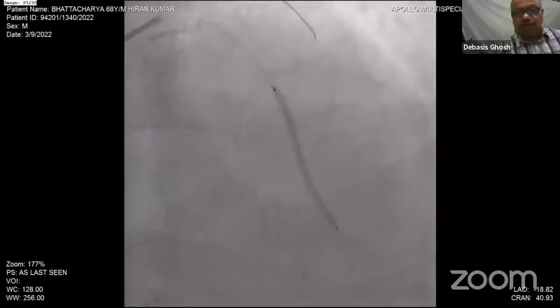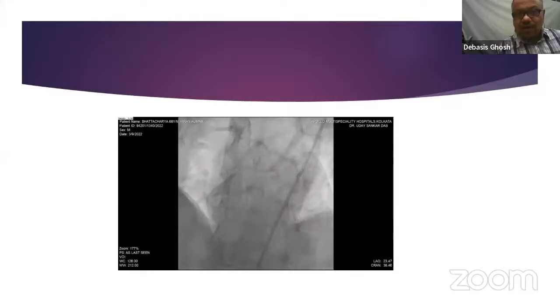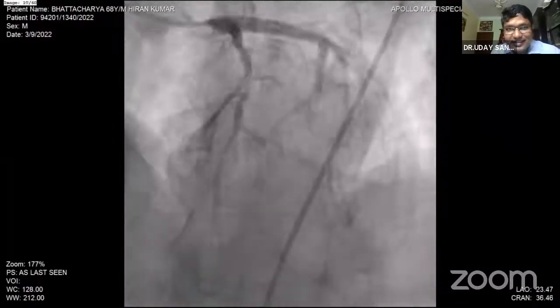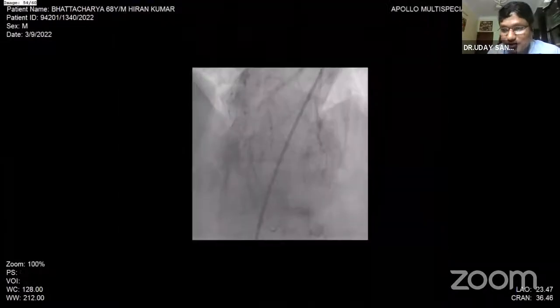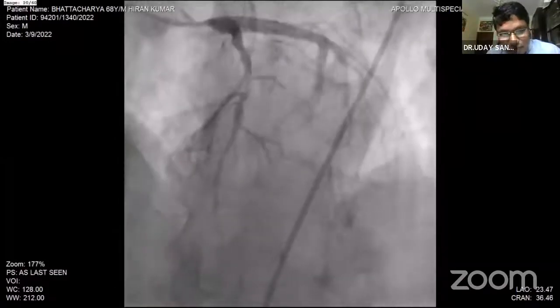The other thing I'll quickly come in on is that the problem is if you have a layer of thrombus around the artery which you are not very aware of. Sir, this was my primary PCI lesion. So I thought it was not a very thrombotic lesion initially, but that came out to be a very no-flow situation with horrible hemodynamics. And the patient came slightly late, at 10 to 12 hours.